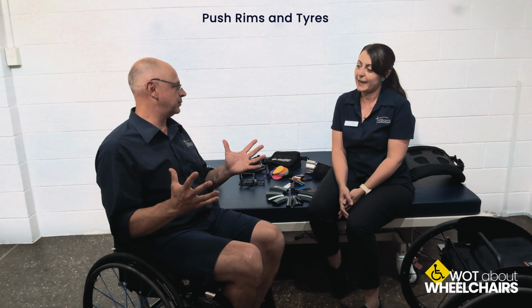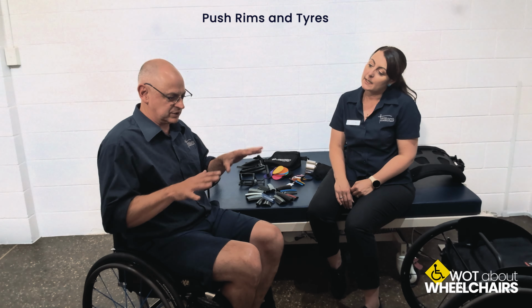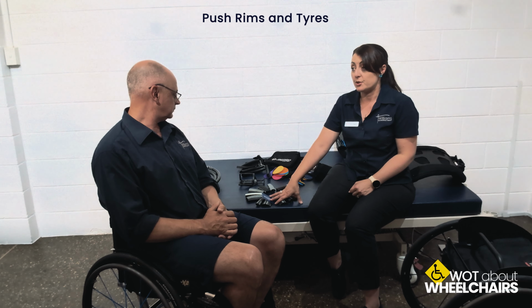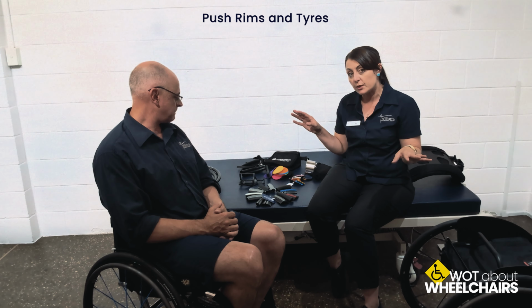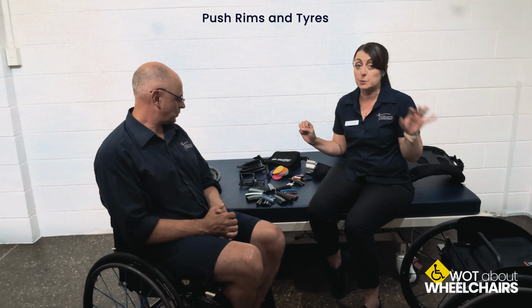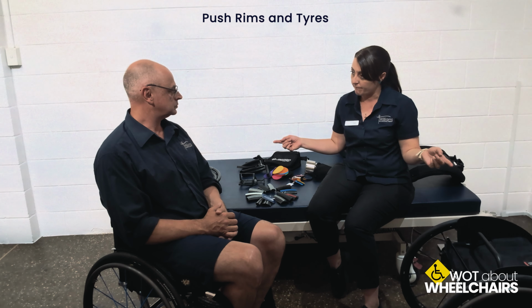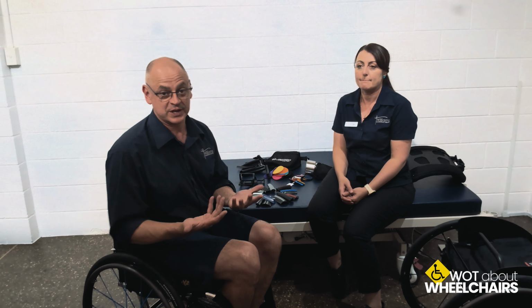But I'm assuming that like a mountain bike, when you're on a smooth surface, it's going to be slower, as you've got all these lovely bits on your tyre. So sometimes, depending on where you live or where you're using your wheelchair, you might actually look at a spare set of wheels, so you can change them depending on what you're using it for.